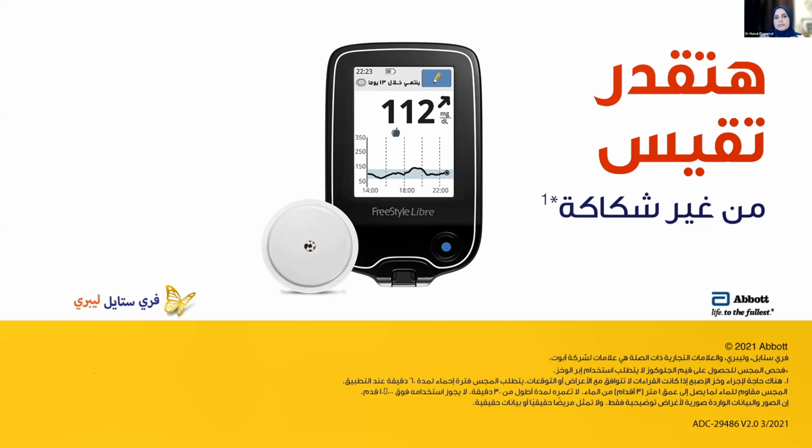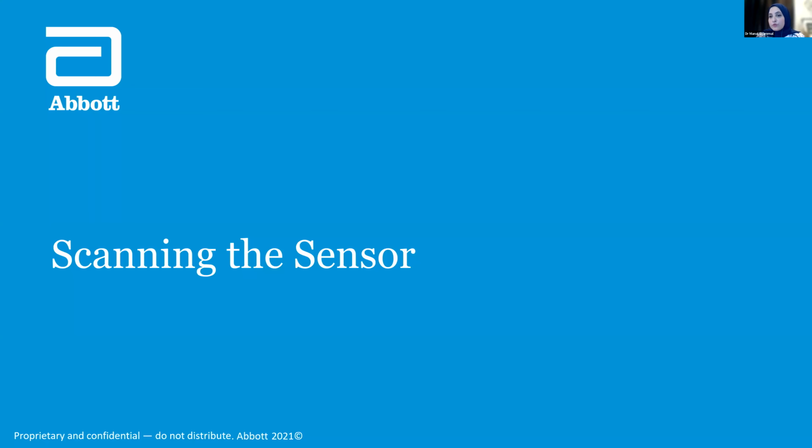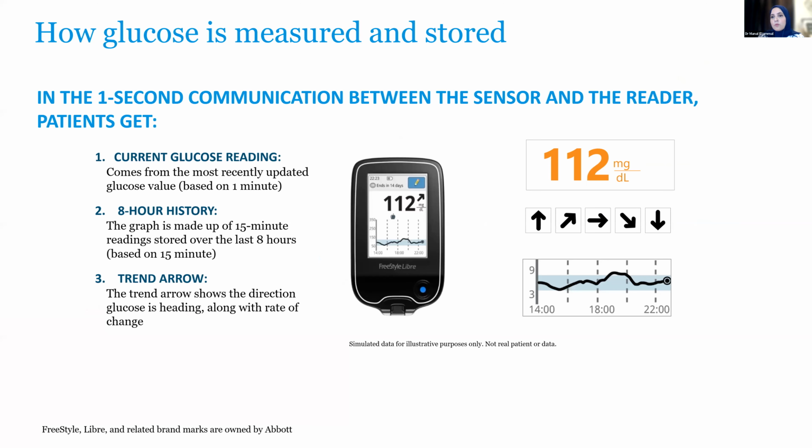And of course, the device is approved to be used without any confirmatory finger sticks, unless the symptoms don't match the readings. That's as per the label. The patient can make decisions based on the readings they get. That's why we say you can now scan without a finger prick. So after the 1 hour warm-up period, what information can we start accessing from the sensor? Following a scan, we get three pieces of information. We get the current glucose reading, which is shown here in this example as 112 milligrams per deciliter.